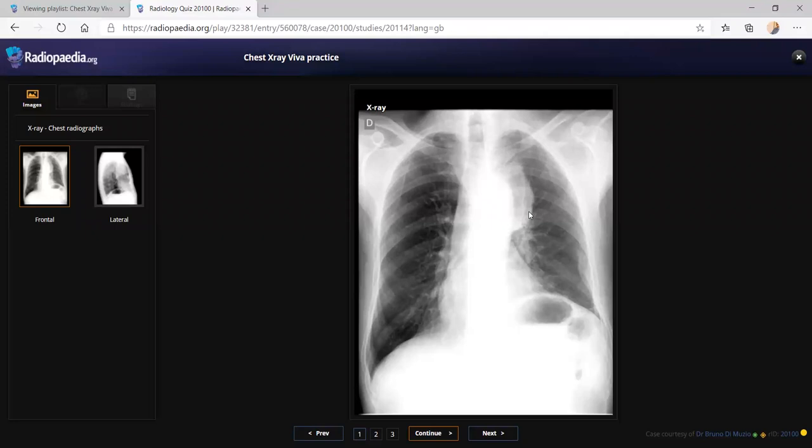So once you diagnose an anterior mediastinal lesion in a middle-aged or above middle-aged patient, then you just directly go for the differentials. You just say that there is no calcification, so I'm thinking the possibility of a thymoma or lymphoma, but teratoma is unlikely. And then you have to tell that you will compare the previous film, refer to the chest MDT and arrange for a CT chest to arrange a diagnosis. And like that, you have to finish faster, within 2 minutes.